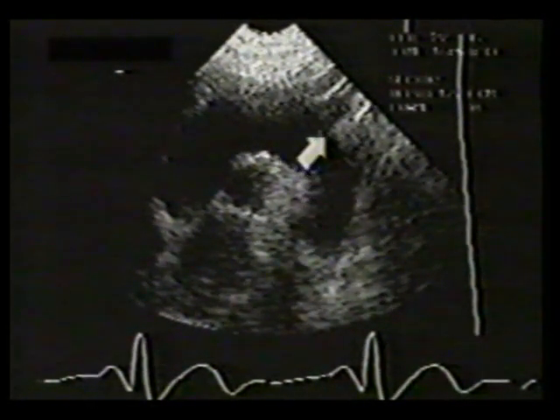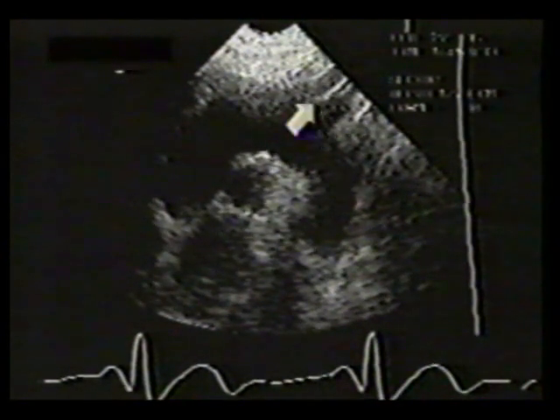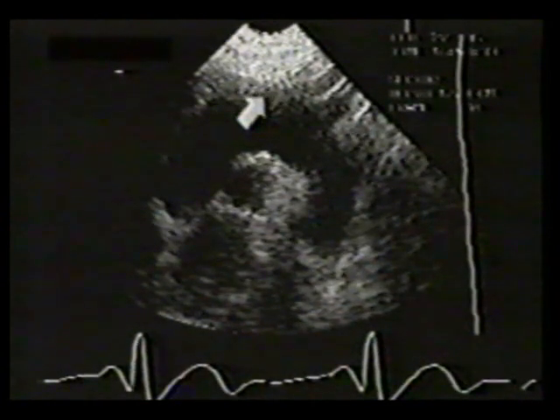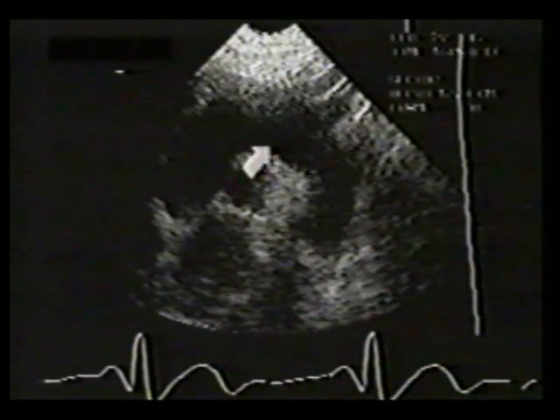The origin of the left subclavian artery and the left carotid are also seen, while the origin of the brachiocephalic artery is not well visualized in this particular scan. Just beneath the arch is a short axis section of the right pulmonary artery.